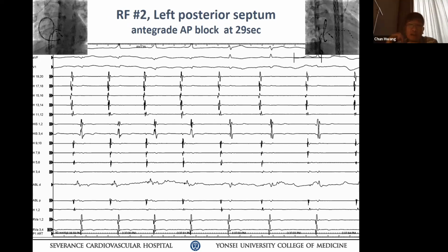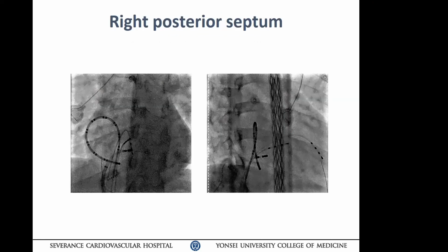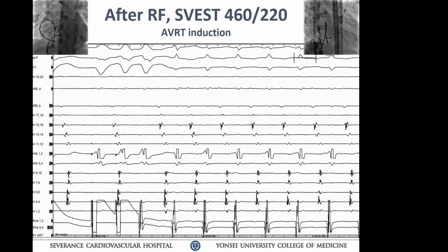Excitable gap이 생기니까. 나중에 보니까 말씀하신 대로 ligament of Marshall 쪽으로 쭉 slant하게 올라가는 바이패스 트랙이었고, 제일 마지막에 없어진 자리는 MCV.